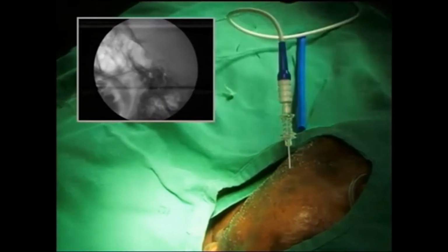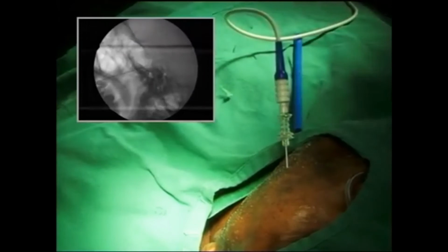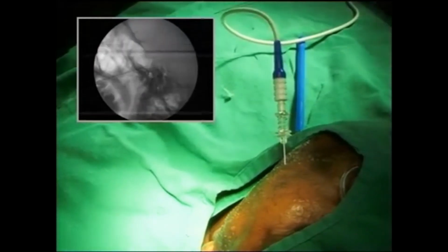So I'm doing motor stimulation right now. There doesn't seem to be any motor contraction. Okay, so I've gone up to 0.8 now. There is no masseter contraction. Stop. Okay. Now we'll do sensory.